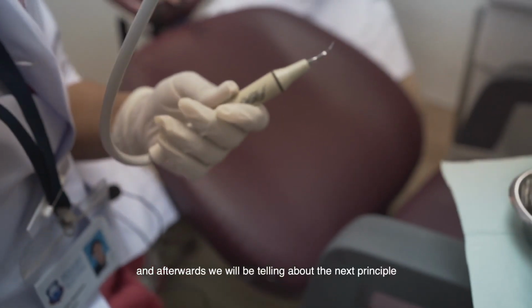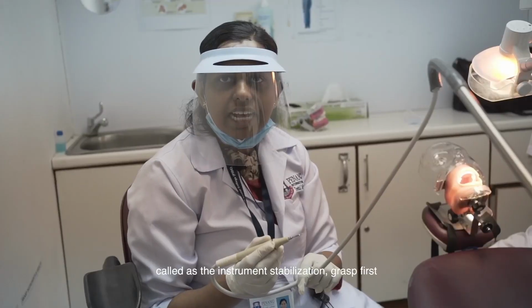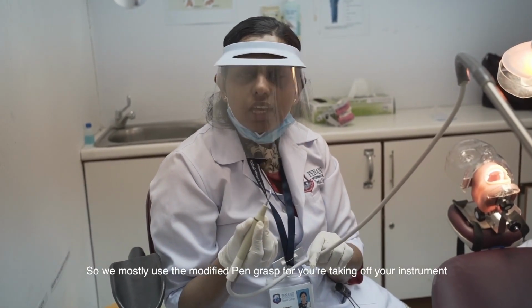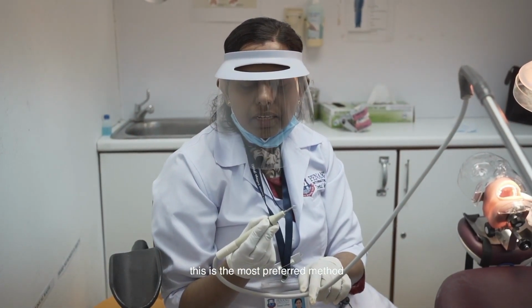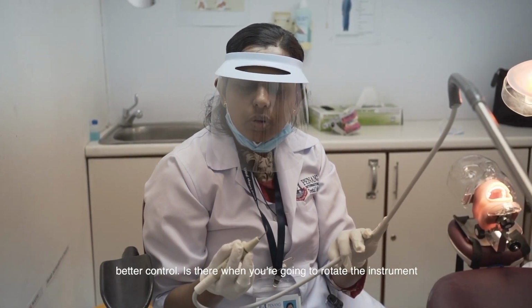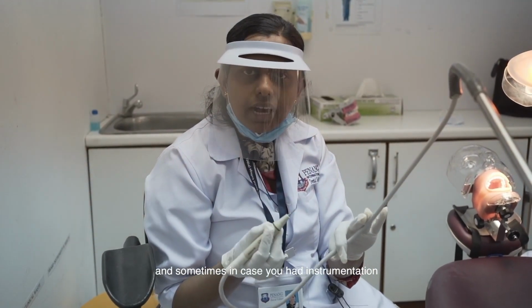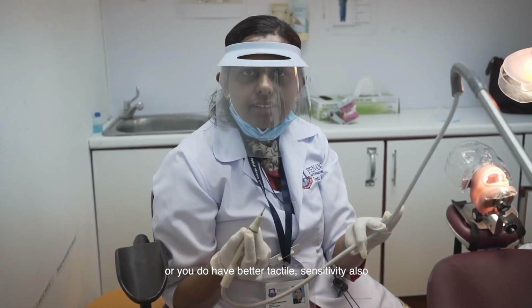Afterwards we will talk about the next principle called instrument stabilization. The grasp first. We mostly use the modified pen grasp for grasping your instrument. This is the most preferred method. The reason being that the tripod effect acts on the instrument, whereby you can stabilize the instrument better. Better control is there when you rotate the instrument, and you also have better tactile sensitivity.